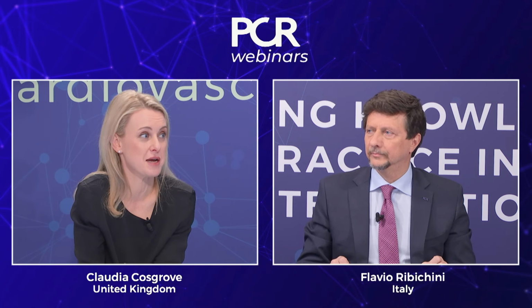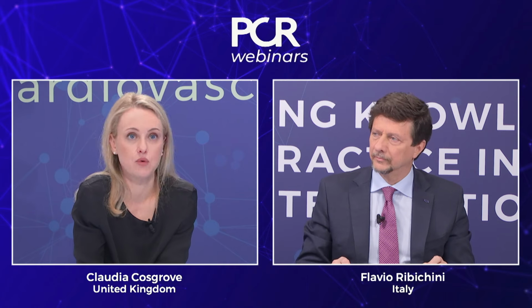I like your choice because probably it is the easiest and the simplest, and this is what the webinar is about. It's just inflating a balloon, from what I have understood. But I have a couple of questions. First of all, for instance, did you consider using rotational atherectomy in this case? I didn't think that it was necessary. I think that's certainly a consideration, particularly where there's a bit of bulky nodular calcium. There are potential risks of using rotablator in a STEMI situation. Again, we worry a bit more about no reflow, perhaps. It's also maybe a little bit more onerous to pull out the rotablator in the middle of the night in a STEMI when you might have less support around.